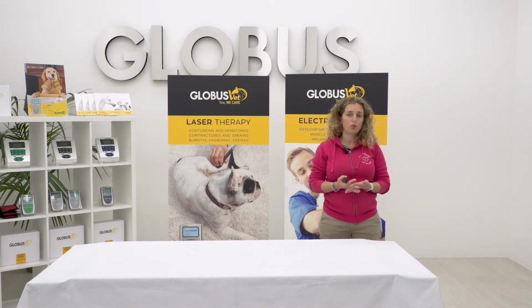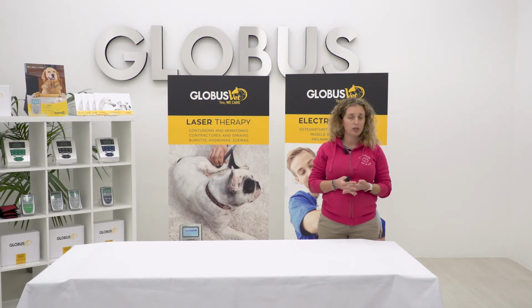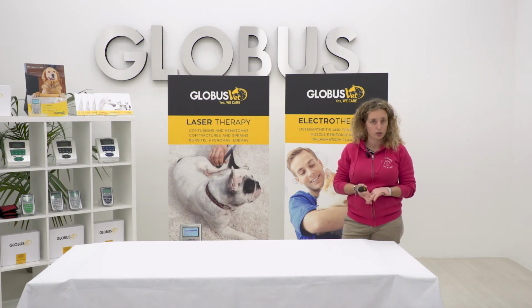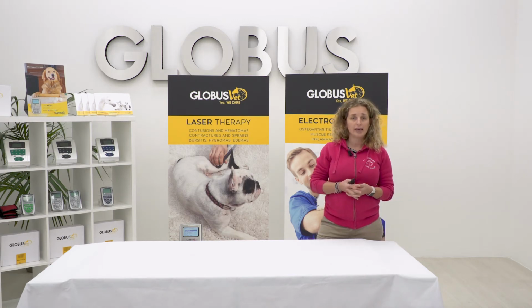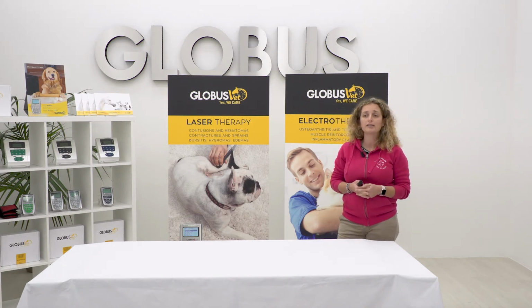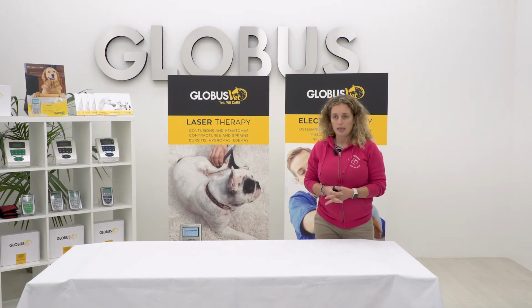Therefore, our rehabilitation protocol includes a treatment with laser for the right elbow, because in any case radiographically we have seen the presence of arthrosis. TECAR on the left carpus, because it is the most painful joint, and laser always in the left carpus. Why did we choose these methods?